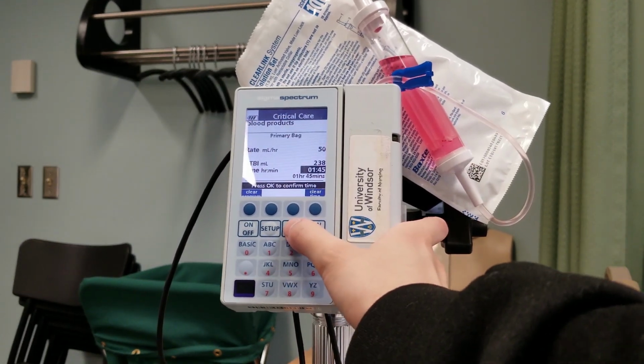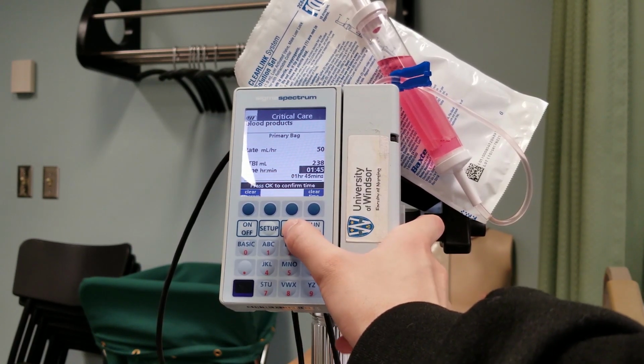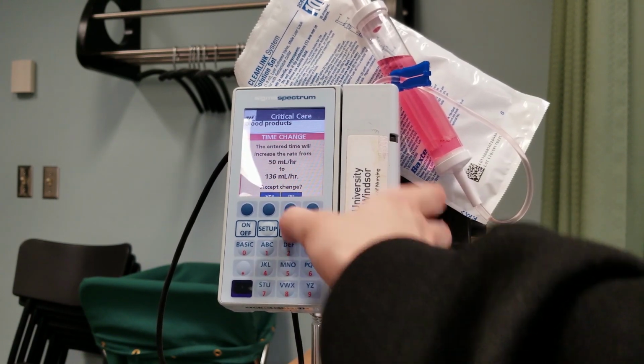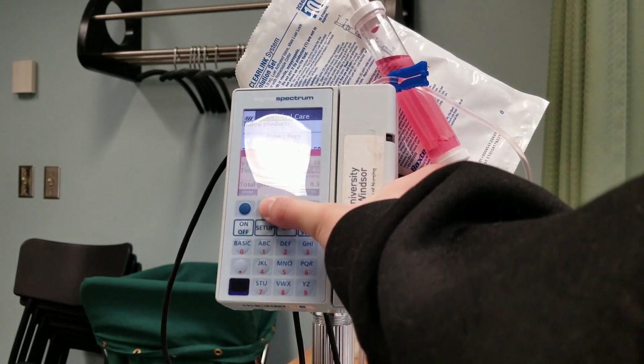Perfect. And when I click OK, it's going to ask me, hey, you're changing the rate to a significant amount. Are you sure this is what you want to do? And this is where I'm going to look back at my math and make sure it's somewhat near. So it's telling me you want to change your rate to 136. I'm going to check what I calculated, which was 135.71. That works for me. I click OK.